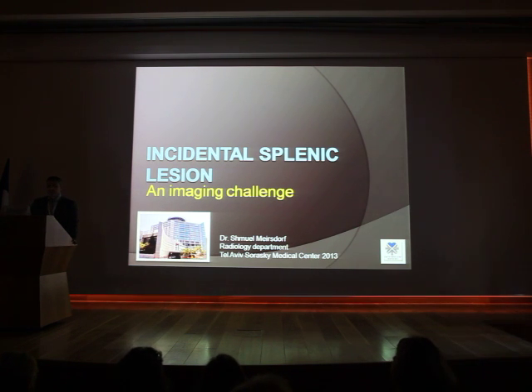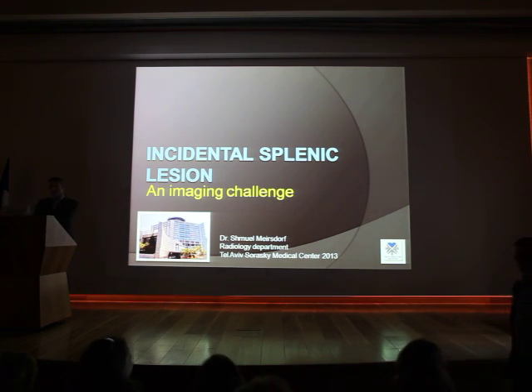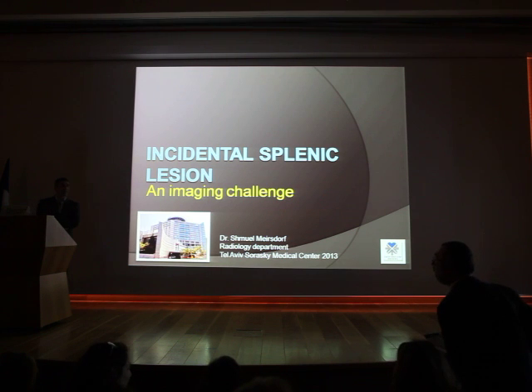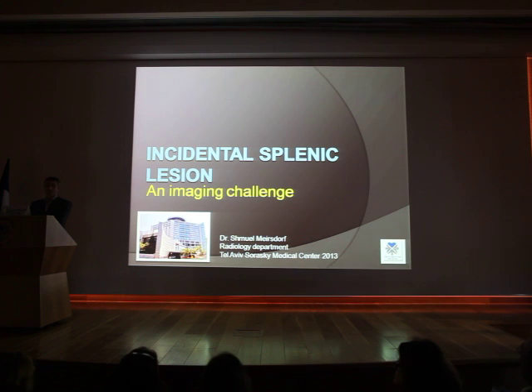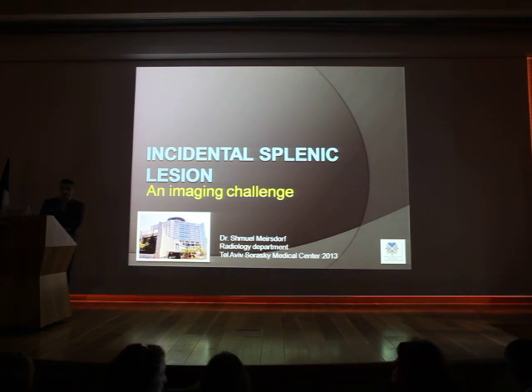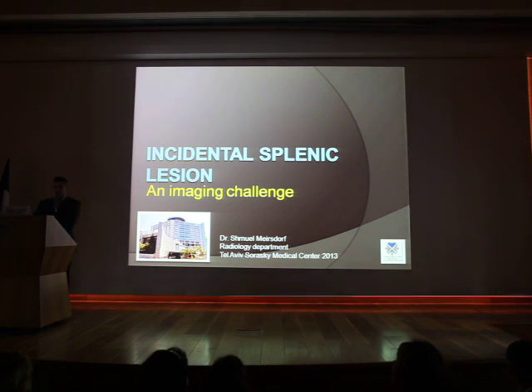Okay, so I chose this spleen topic because I think it's a common problem that we have a challenge when we see incidental splenic lesions, and usually I feel sometimes that I didn't know what to do with it, so I decided to investigate it, and that's where the talk came from.